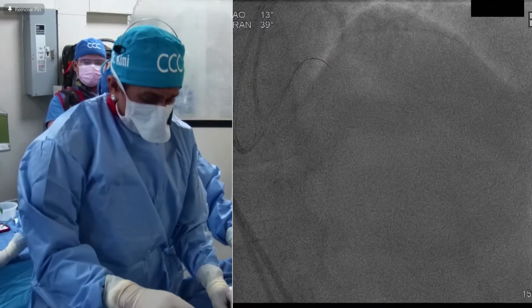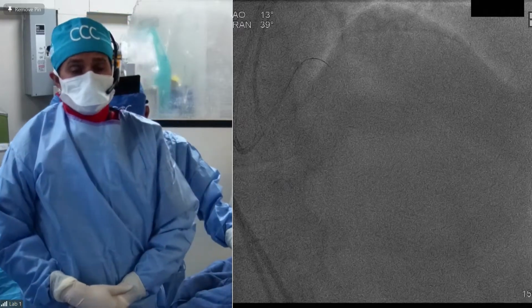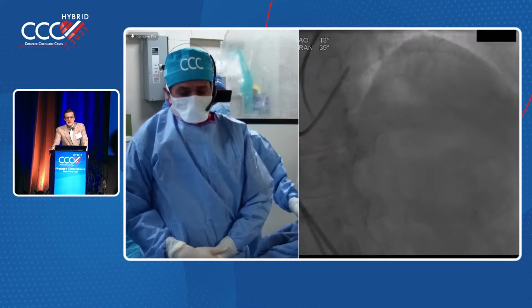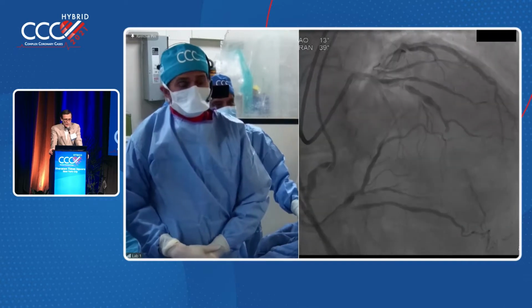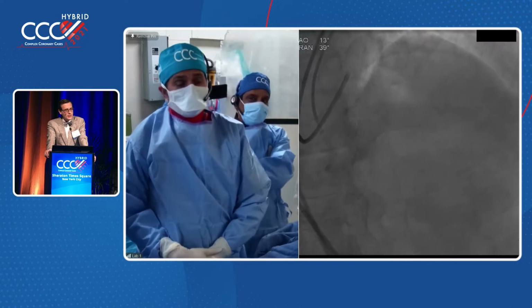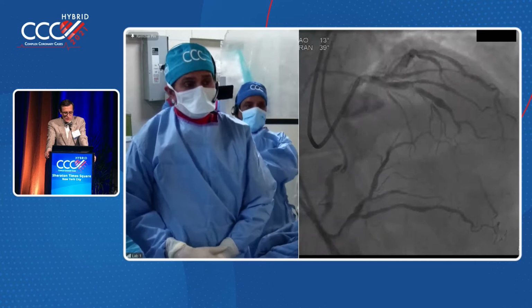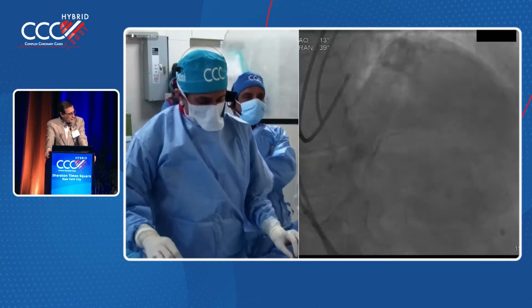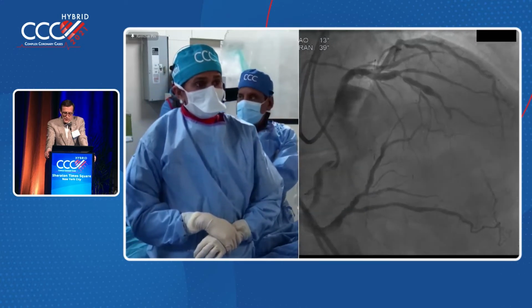Now, George, you can carry on while we are planning. Yeah, absolutely. First of all, this is a double case. It's a CTO as well as a bifurcation proximal to the CTO. We get in the CTO, label it as a CTO, and we get the bifurcation as a bonus. Dr. Puskas is joining us right now to talk a little bit about the possibility of robotic closed chest revascularization of this LAD and diagonal. Would that be an option, John, based on your experience, for this patient?